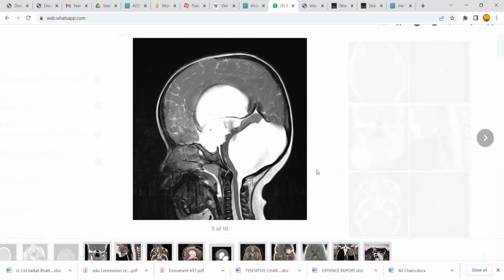Posterior fossa arachnoid cyst. Nidesh? With communicating hydrocephalus. Pratibha? Of these, only Yogesh has got marks so far. Still, with posterior fossa arachnoid cyst with obstructive non-communicating hydrocephalus.